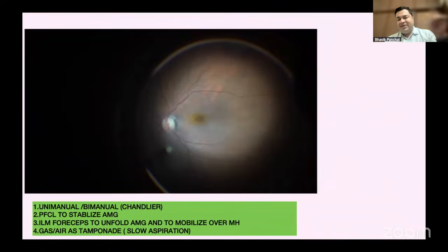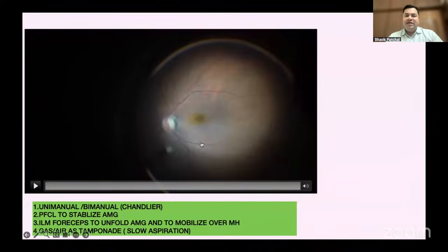We ended on a note on larger macular holes. So we come to the next chapter, the final chapter about larger chronic macular holes, where the hole on OCT is stuck to the underneath and the neurosensory retina is stuck to the RPE underneath. So what do we do with them? For that, let us begin with the first video about using the amniotic membrane graft. Again, we have Dr. Avnish for that.